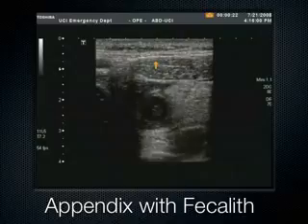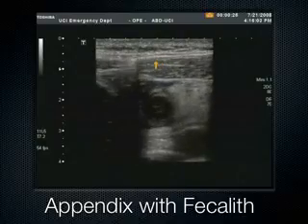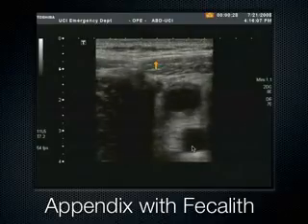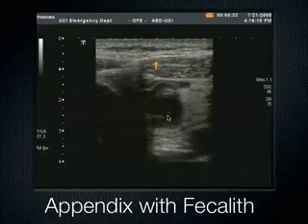This comes up all the time with the gallbladder. People go, oh, what's that thing over there? What's that mass in there? And it's just the duodenum, seen on end sometimes, and it can look a lot like this. It looks like any other part of the intestines. We'll get to that in a minute.